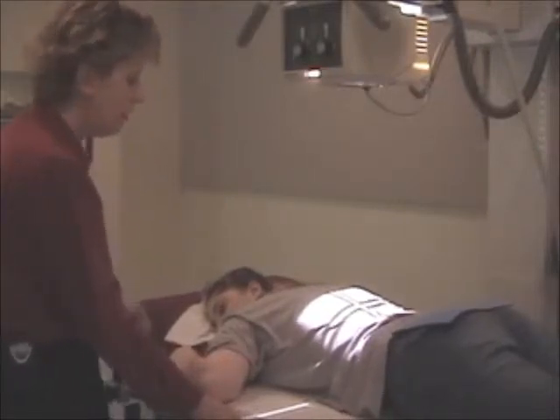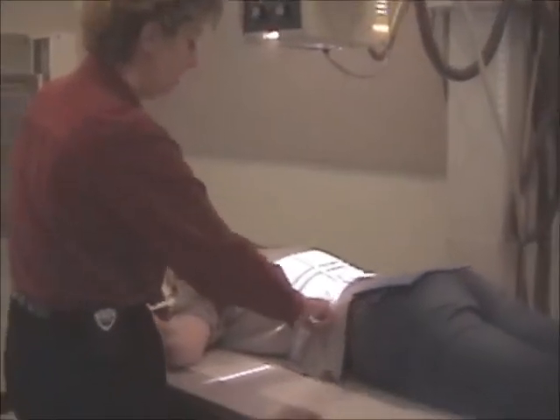Now if she's underweight, you would take the iliac crest, tip of the scapula, go halfway as your baseline, and then you would drop down 1 inch for the hypo. And if she was asthenic, that's even tinier, the stomach drops even more, you're going to be 2 inches below. Okay?